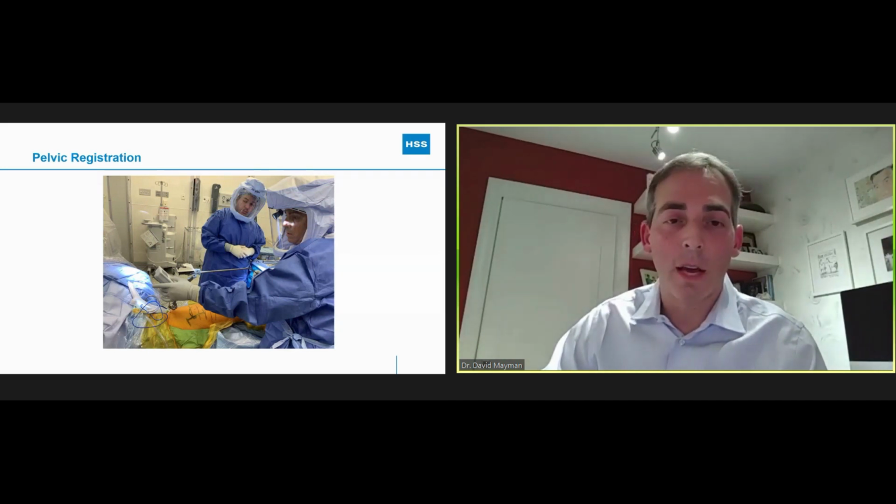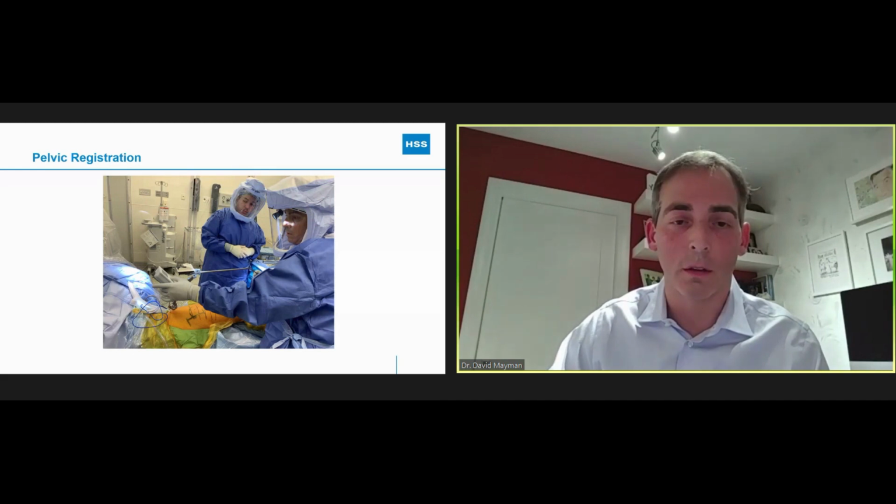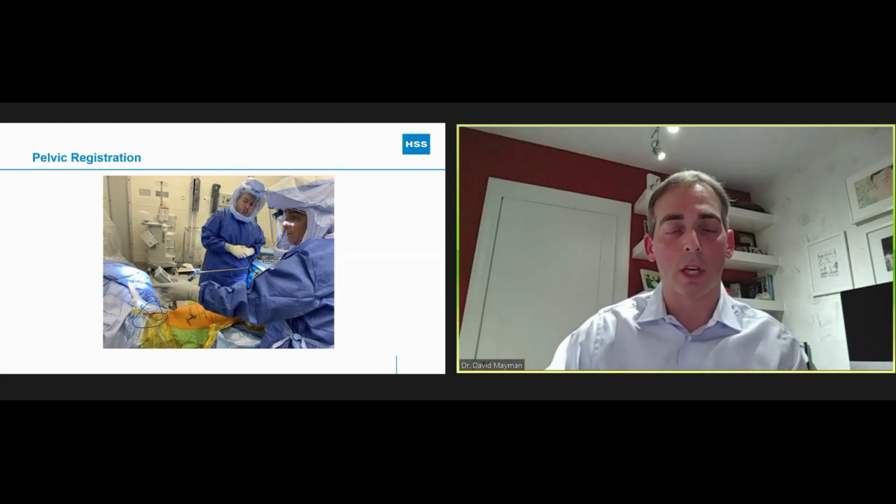And as Steve said, and I'll grant him this absolutely, this depends on your pelvis being level when you start the case. So I always check on the position of the pelvis before we prep and drape. This isn't something that I let an intern or a resident or a first-year resident, second-year resident position the patient. I always check on the patient.